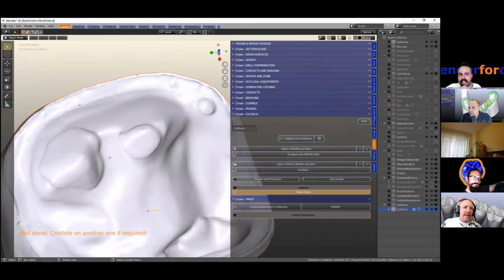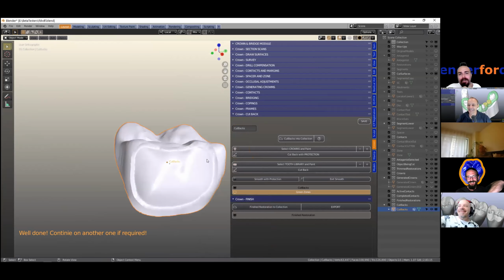Can I ask my last question tonight? Yeah, of course you can. I was thinking about how the live stream works when it comes to designing an upper and lower restoration at the same time. Oh, you were asking me? So we're going to get into that in one of the next phases, upper and lower together.